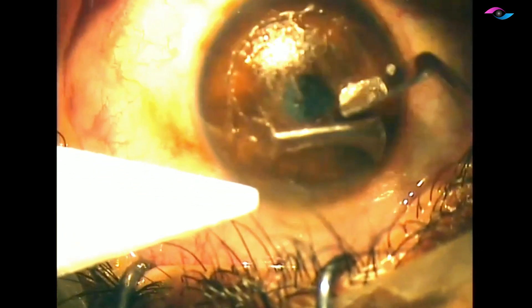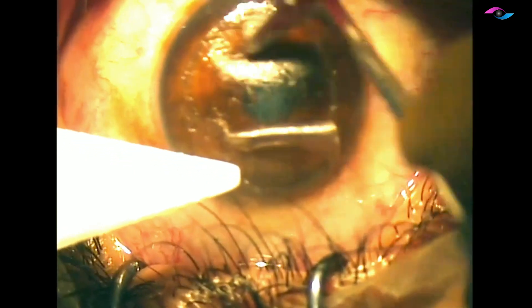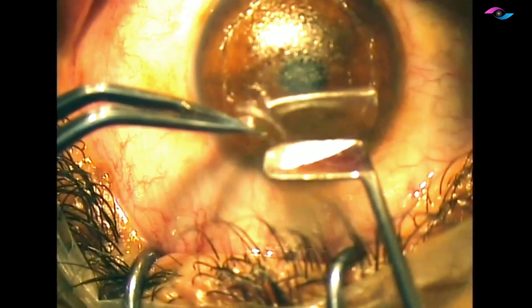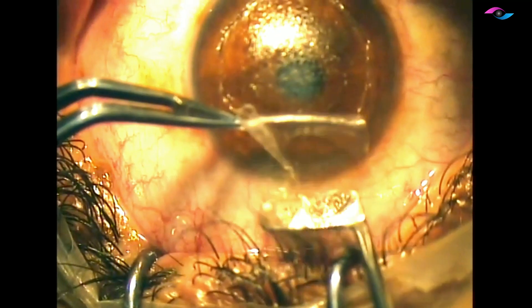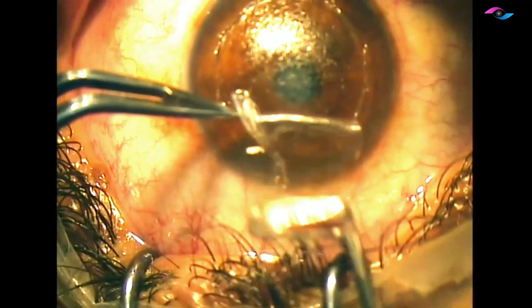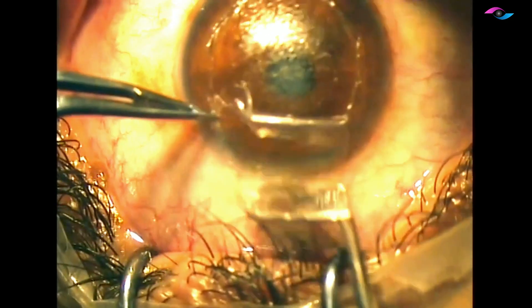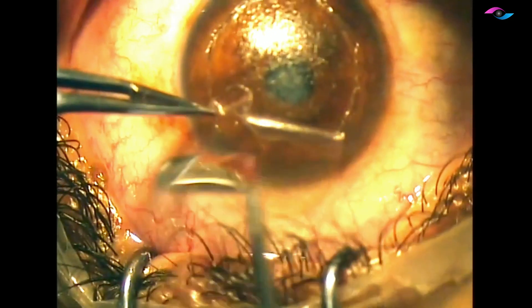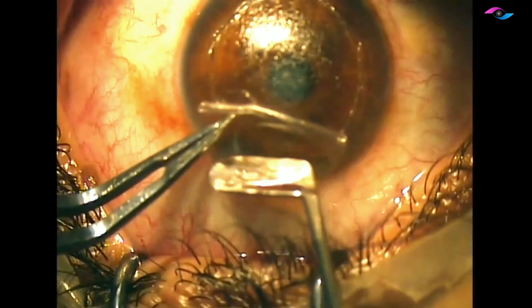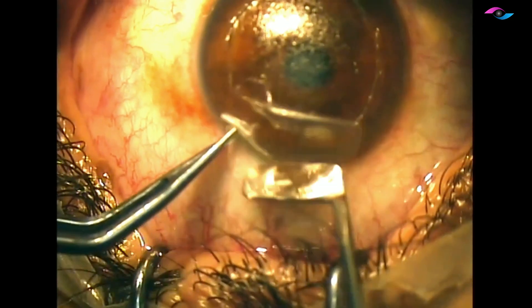It is also very important to take care of the underside of the flap. We have reflected the flap here, and again gently supporting the flap with McPherson's forceps, we are debriding all of the seeded epithelial cells from the flap as well. We can see here that because of the trauma there is a small flap tear next to the hinge.